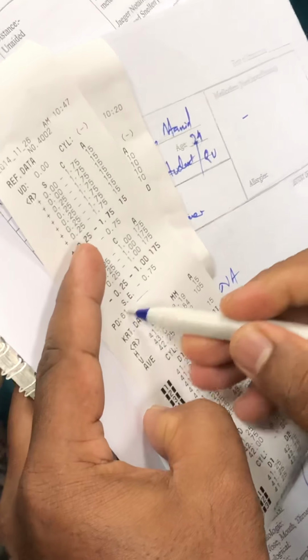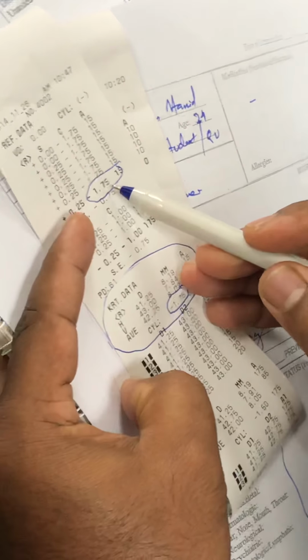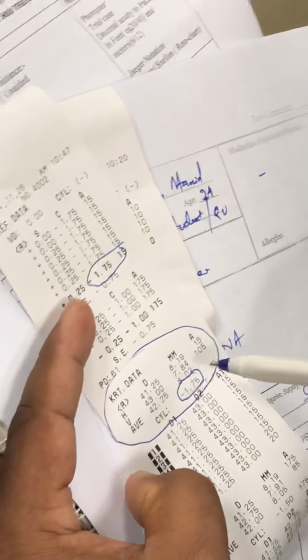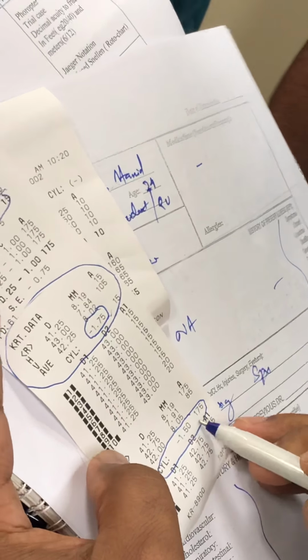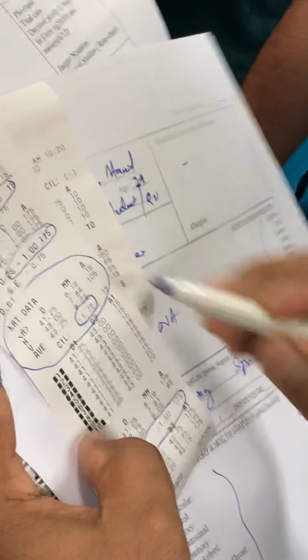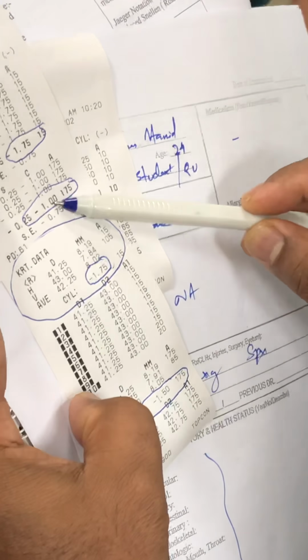This is the keratometry data. Look at the keratometry cylinder. It is 1.75. Look at the autorefractometry cylinder, 1.75. That means your corneal cylinder and the refractive cylinder are the same. But in some people, the refractive cylinder and the corneal cylinder may be different. Here also it is 1.5. See, left eye 1.5 you have by keratometry, but in the refraction you have only 1. That means where is the 0.5 cylinder? It is corrected actually by the lens. So there is a difference in the corneal cylinder and the refractive cylinder.